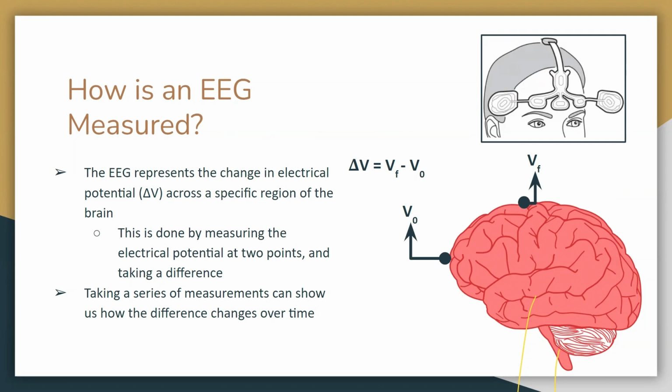And the reason why we work in decibels is we can do an interesting math trick that cancels the resistance out of the calculation. So what's being plotted is not the power, it's directly proportional to the power. By putting it in log space, I can ignore the constant. The constant comes out of the math and it falls out. So once I've gone to dB, I'm in made-up magic unit space. If it sounds like I'm just talking about random math tricks, it's because I am.